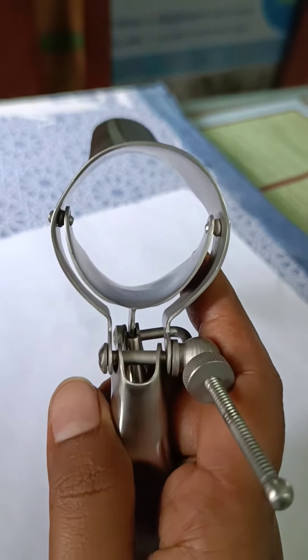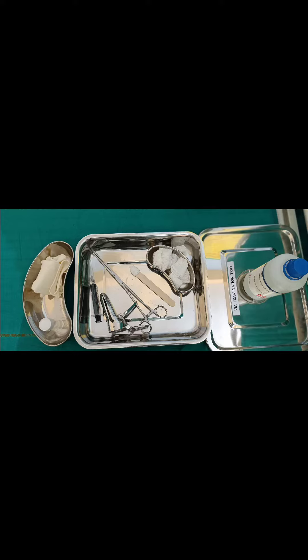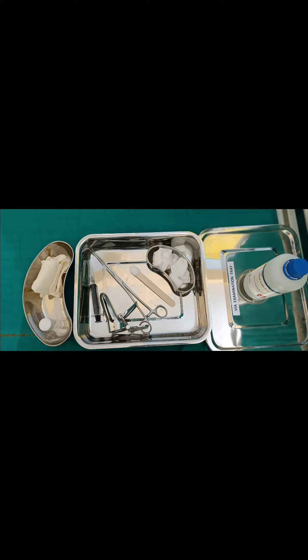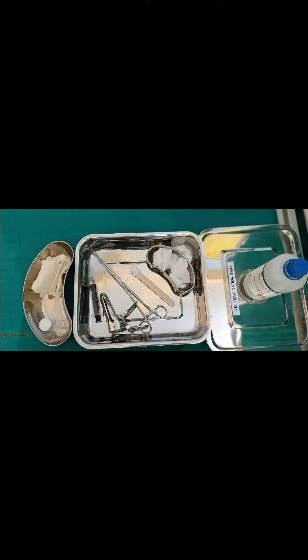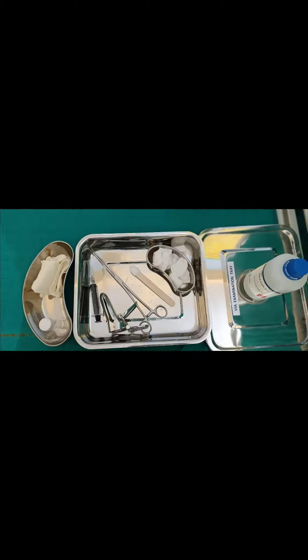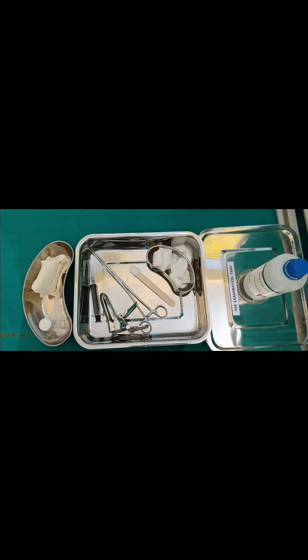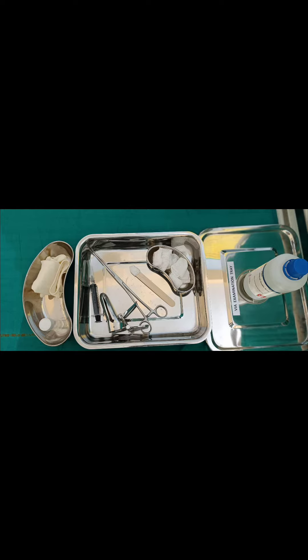You can then properly visualize the ectocervix or mouth of the cervix. Another item on the tray is a disposable syringe for diluting glacial acetic acid. Next is a swab stick — if you don't have a swab stick, you can use a spatula with the end covered with a gauze piece. Also included is one pair of hand gloves for the procedure and a container with dilute acetic acid.